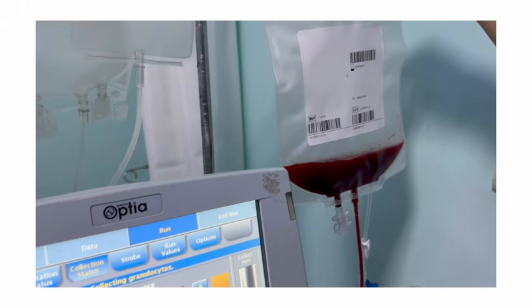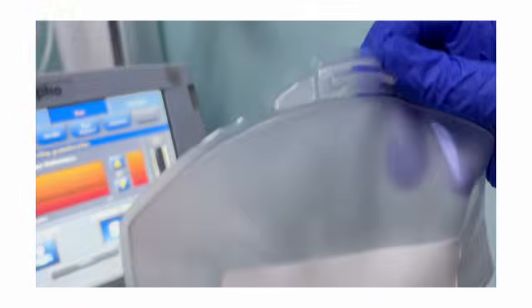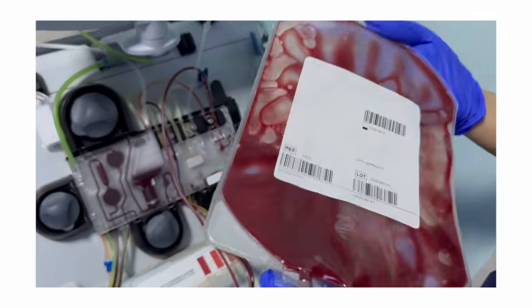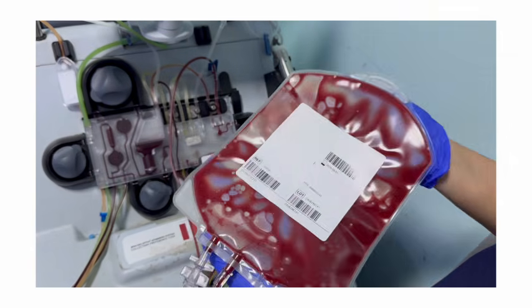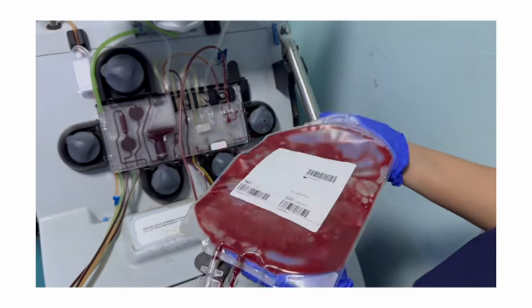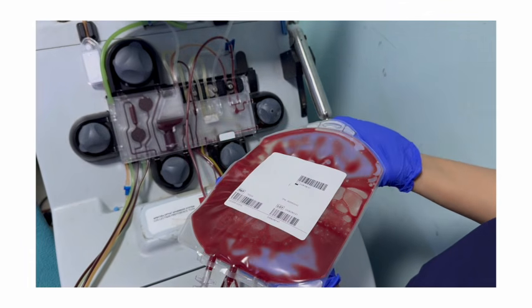Based on the CBC values and WBC count of the donor prior to the procedure, a mid-count sample has to be taken after attaining a certain volume of the granulocytes during the procedure. So for taking the mid-count sample, the product which has already been collected in the bag should be mixed gently and thoroughly in both directions so that the product is mixed properly.